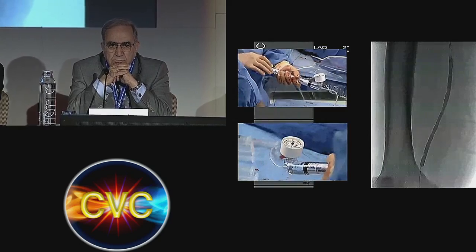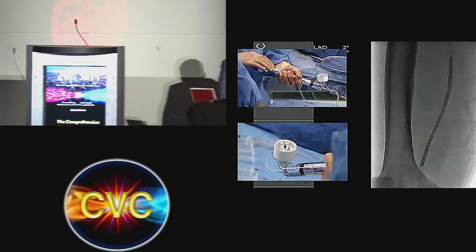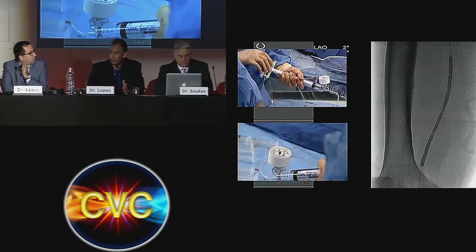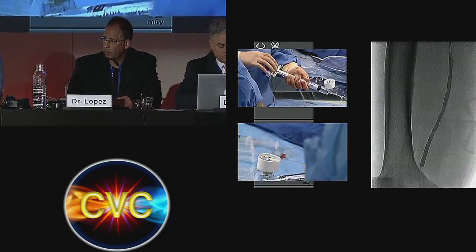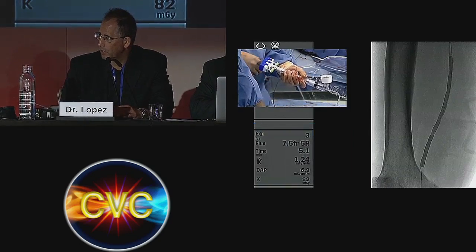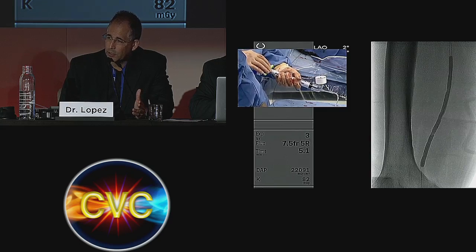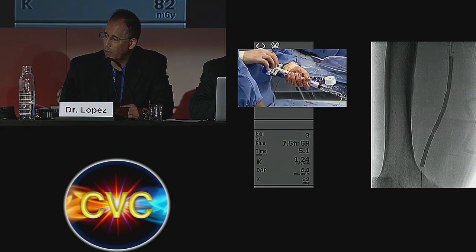One option is to put in coronary drug-eluting stents, and they're off-label, and there's a little bit of worry about whether that stent will get compressed because it's in a compressible area and it's not a self-expanding stent. But anecdotally, in the cases that I've done, they do work pretty well and they stay open.